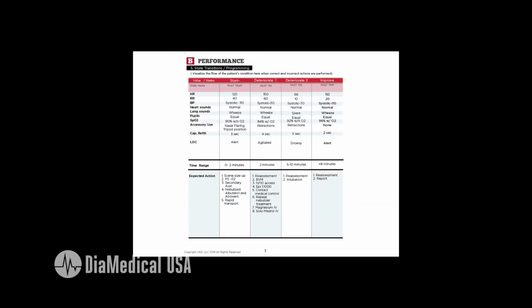At the core are the pre-programmed scenarios, and this shows one scenario. So typically the scenarios will have a start position, and then the patient will automatically deteriorate, or the instructor can set the deterioration, and then based on expected actions the patient will improve or further deteriorate. So the system comes with a binder with all the scenarios and instructions for setup included in that binder.